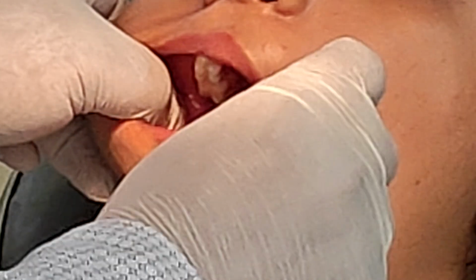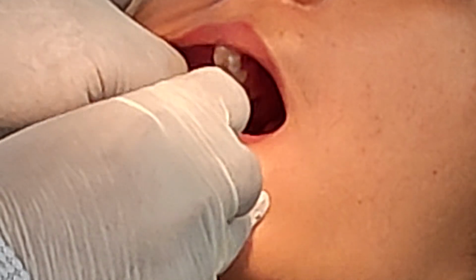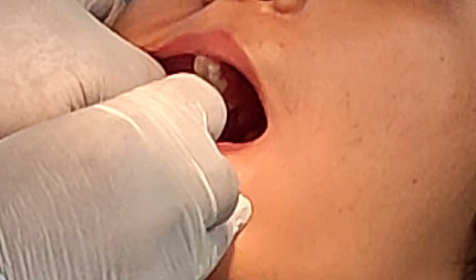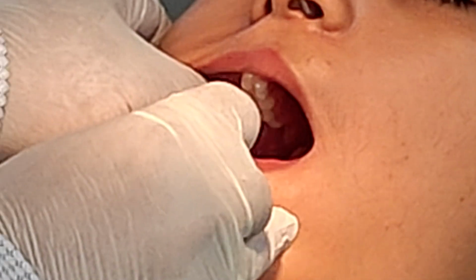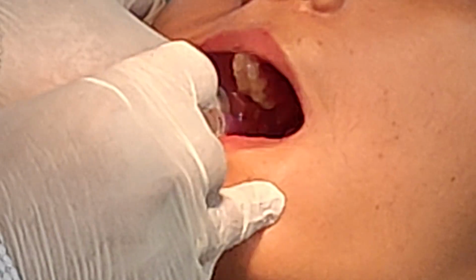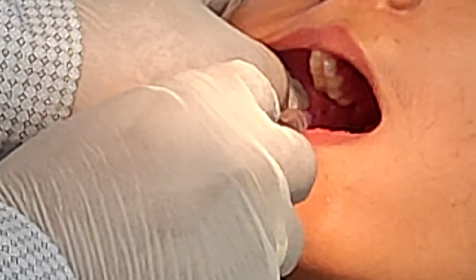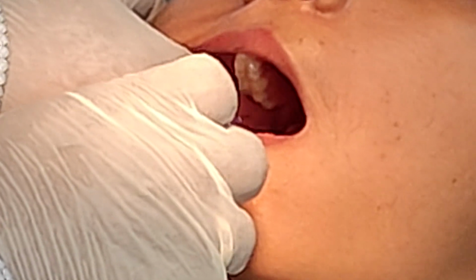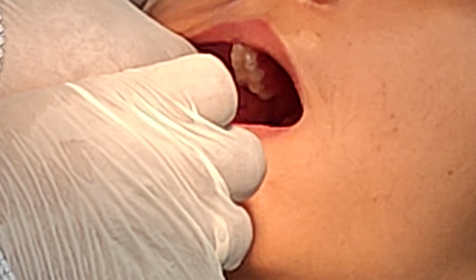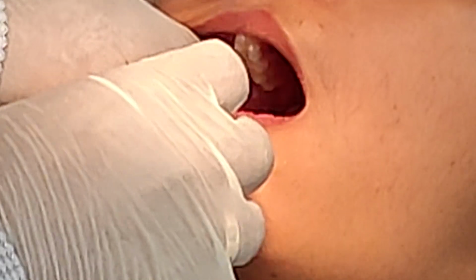Then to give the lingual nerve block, change the direction of the needle in such a way that the syringe now moves from the opposite side to the same side at the same height. Because the lingual nerve is medial and anterior to the inferior alveolar nerve, we have to do this maneuver, and then again aspirate and provide almost 0.8 to 1 ml of solution.